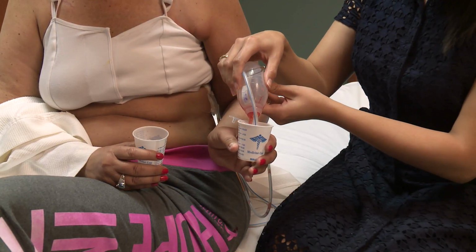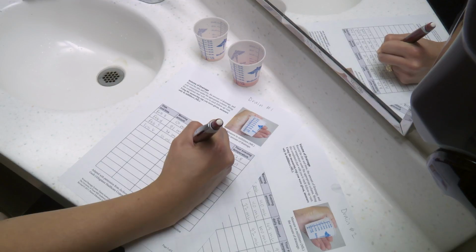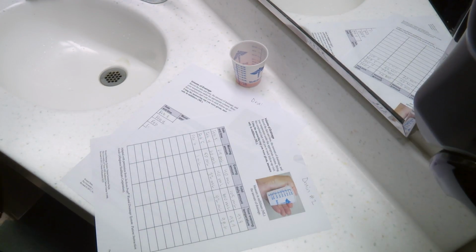2 times a day, empty each bulb. Measure the amount of fluid in each bulb separately and record the amounts on a specific chart. The amount you record on the chart will determine when it's safe for your surgeon to remove the drain.